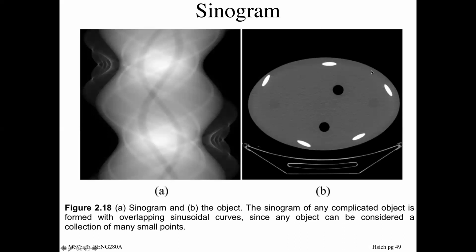When I put my sampling along here and I put parallel beams horizontally through the object, I have a narrower object on my projection data. So you can see as we move through different values of theta, we get this oscillating function.